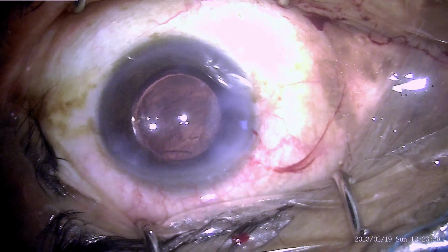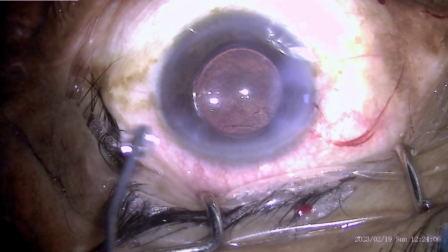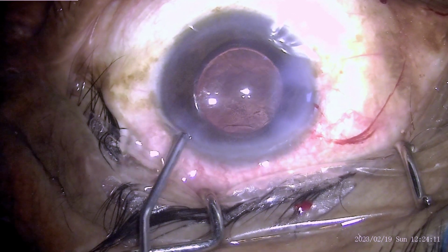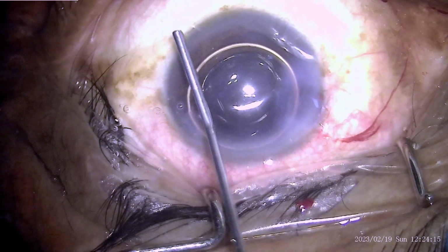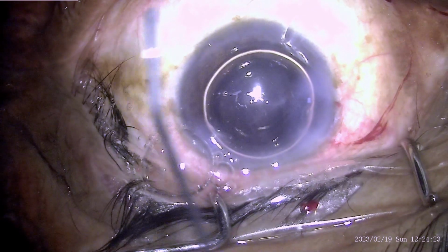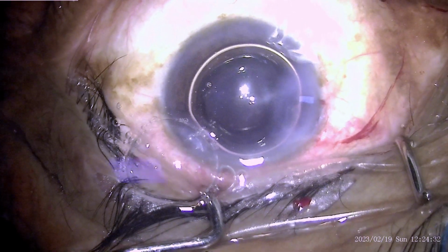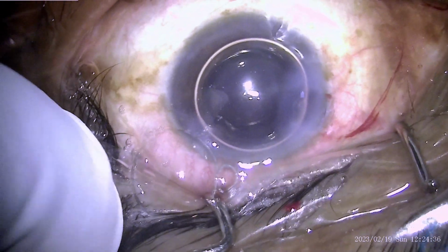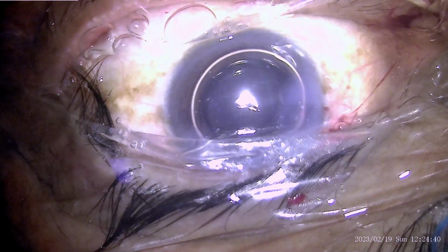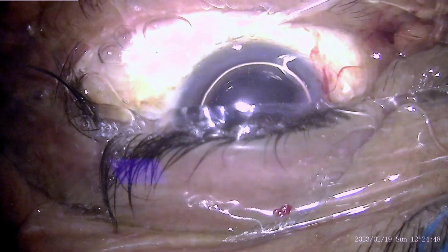At the same time, it's better not to irrigate, aspirate the viscoelastic, because that will hydrate the vitreous and will cause more prolapse. Instead, fill the anterior chamber with air so that the vitreous is pushed back and the IOP is restored, so that the self-sealing wound is working. So the surgery has been finished, although this was an event which was not a desired one.